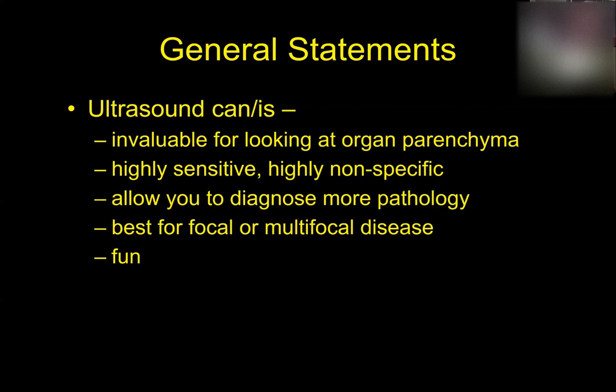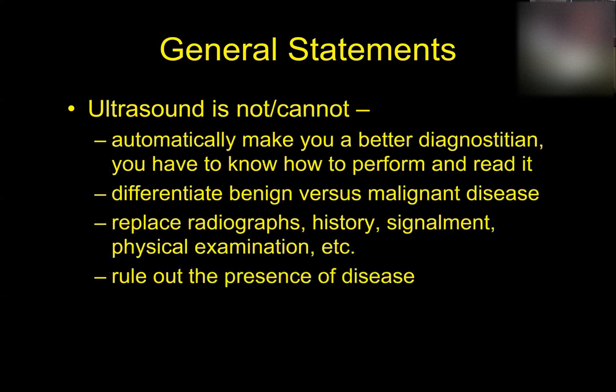And the other thing, the real world thing about ultrasound, is most clinicians, most veterinarians find it fun to do. It's kind of an extra, outside of the abdomen, non-invasive exploratory. You can get your probe and look all inside the organs and try to find disease processes. So most people, once they learn how to do ultrasound, find it fun. Now, like any job, after you've done a billion ultrasounds, the fun kind of goes away, because then it's just routine and just another chore as part of your job. But overall, I think ultrasound still, for most people, is kind of fun to do.